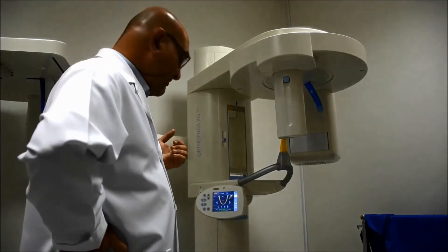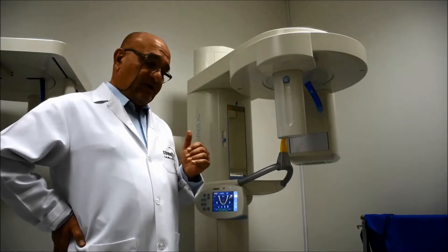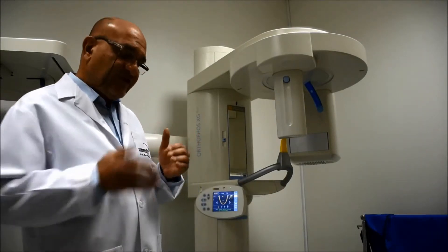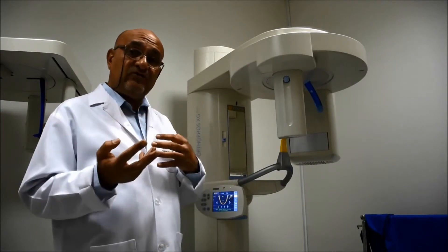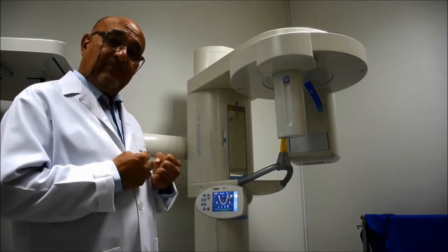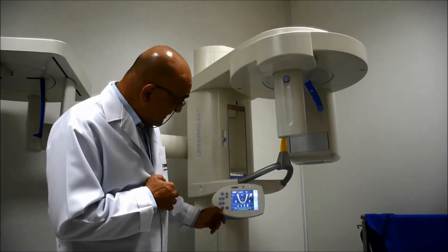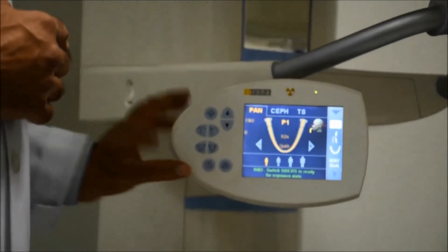If your patient is a bit worried or not well acquainted with these machines, you can demonstrate the exposure without real x-ray generation. Especially with children, we usually tell them that this is a big camera and you are going to have all your teeth shown. To lessen the fear and apprehension of the patient, you click on the button just next to the R button, which is designated as the letter T.